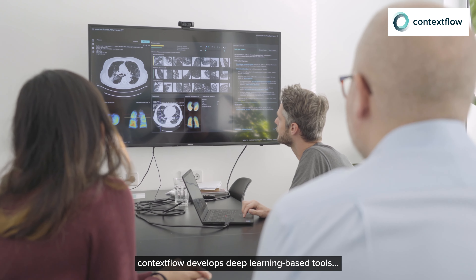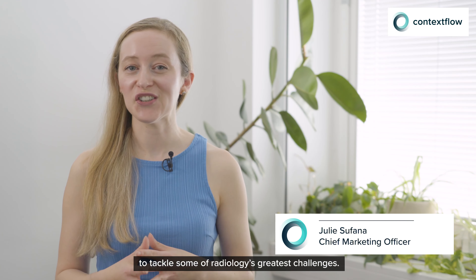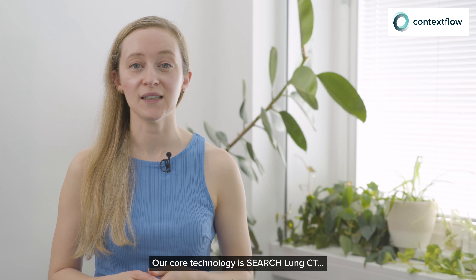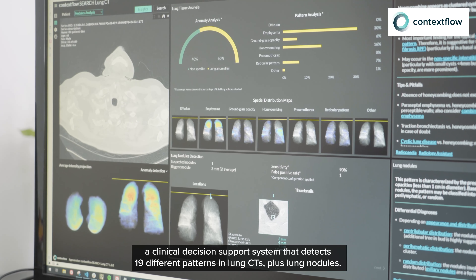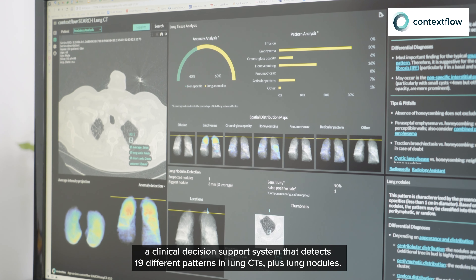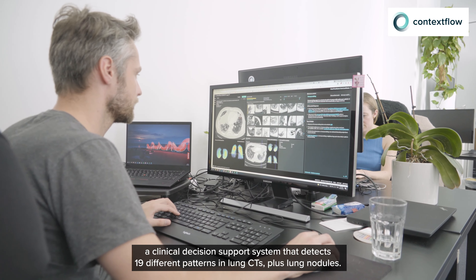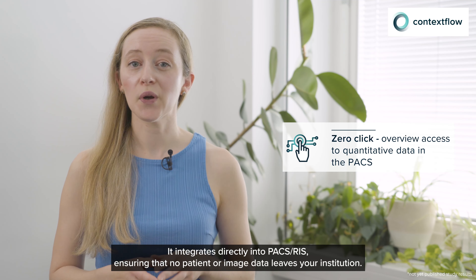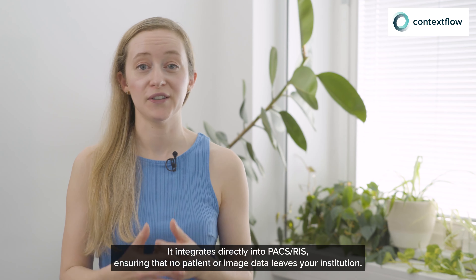Contextflow develops deep learning-based tools to help tackle some of radiology's greatest challenges. Our core technology is Search Lung CT, a clinical decision support system that detects 19 different patterns in lung CTs plus lung nodules. It integrates directly into your PACS or RIS, ensuring that no patient or imaging data leaves your institution.